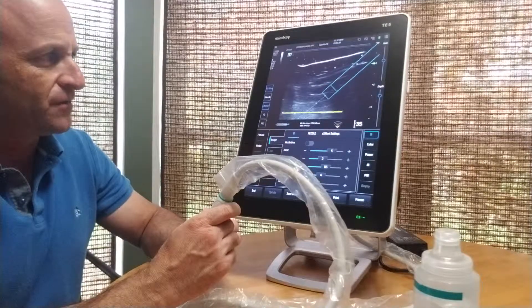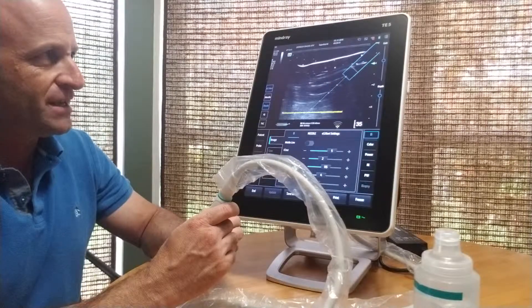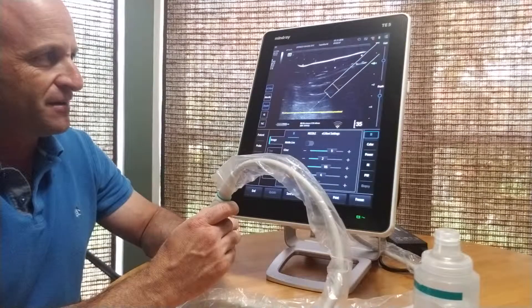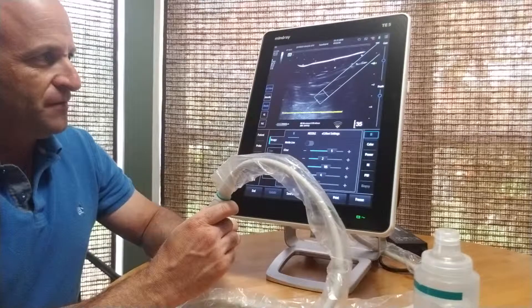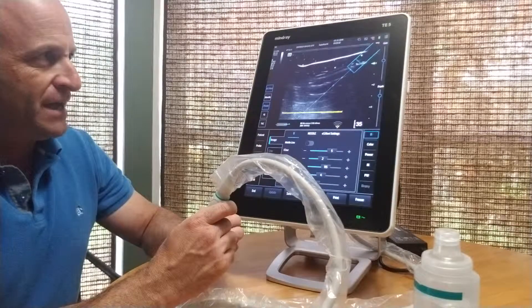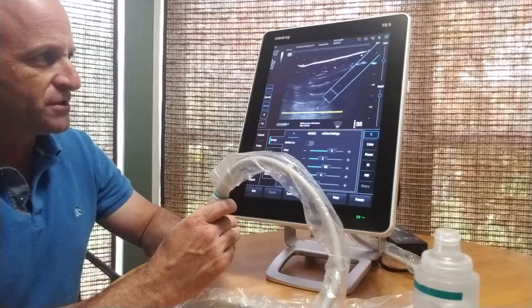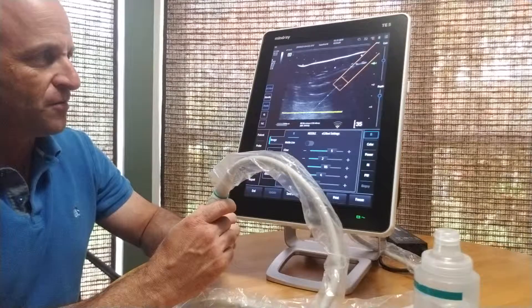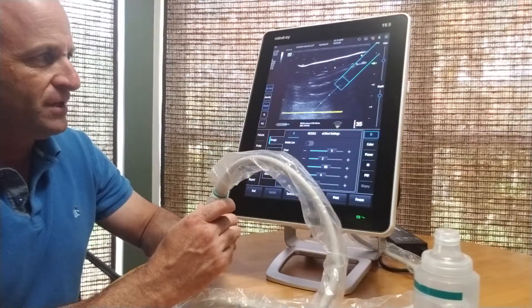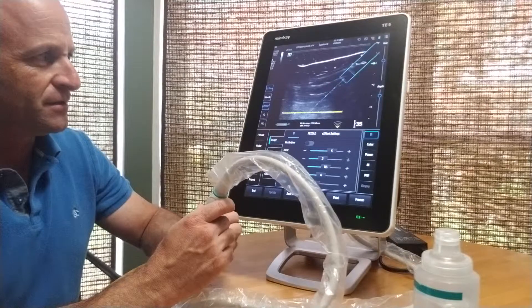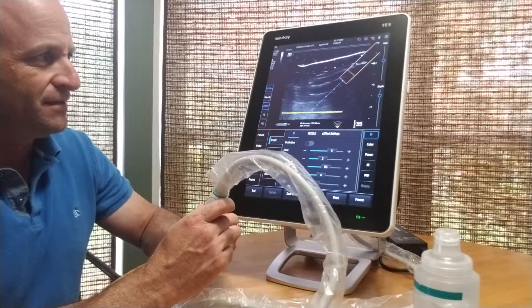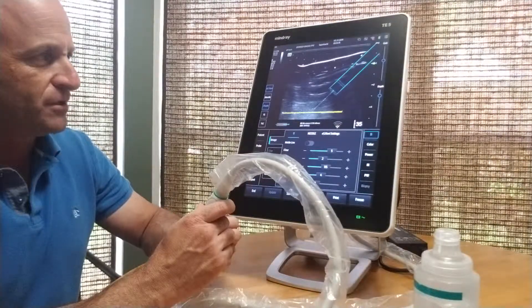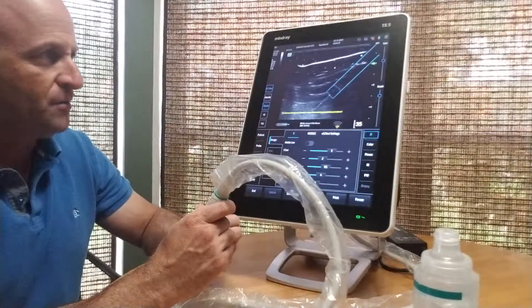It's really impressive overall. When you can see this kind of needle visualization using magnetic technology to visualize the angle, depth, and direction that the needle approach is coming in — you can see the guidelines and whether you're off track. You want to get it into blue, which gets you into the perfect direction. If it's off track, you're not moving in a direct path to where you want to inject. You line up the two components and it's really impressive.